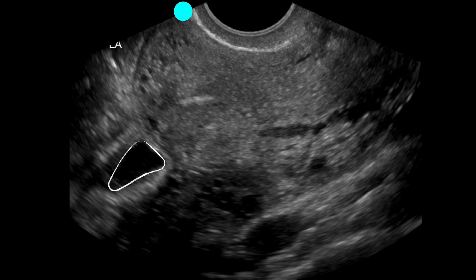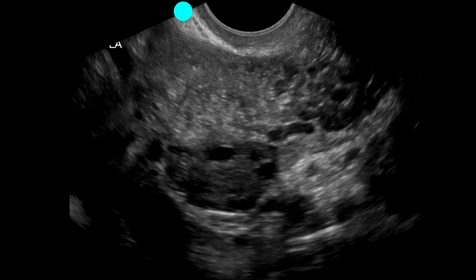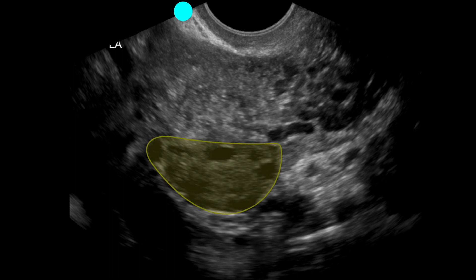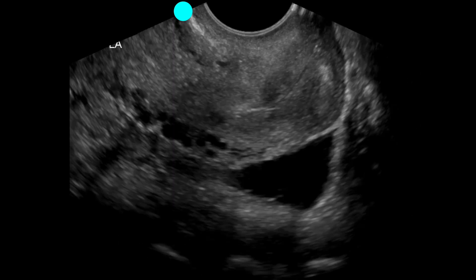We see this structure posterior to the cervix. If you look closely, it has a regular border — this is consistent with fluid contained within a loop of bowel. We also have a structure identified posterior to the uterus which is consistent with an ovary. We're not focusing on the ovaries yet, but we'll keep a mental note of this location.